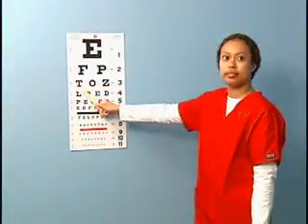Instruct the patient to keep the left eye open. If the patient were to close the left eye, this would cause squinting of the right eye. Squinting in the eye being tested can temporarily improve vision, leading to inaccurate test results. Tell the patient not to squint or lean forward during the test.